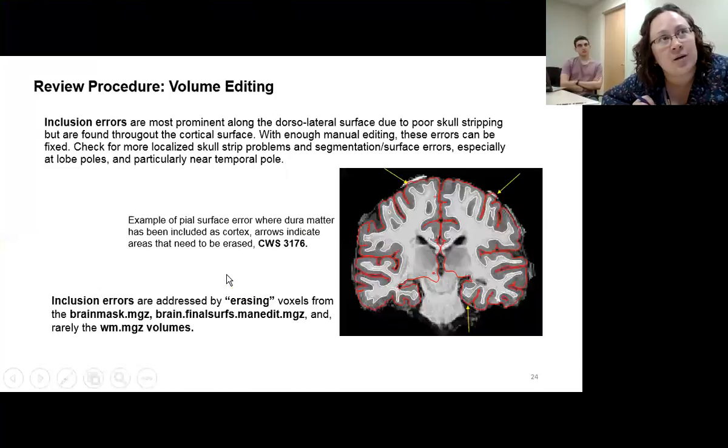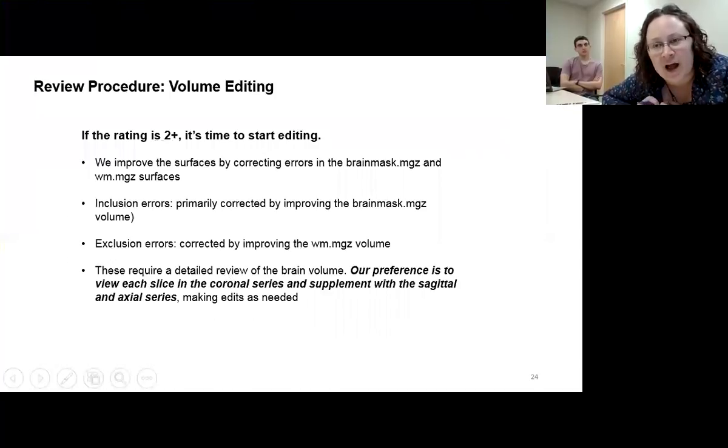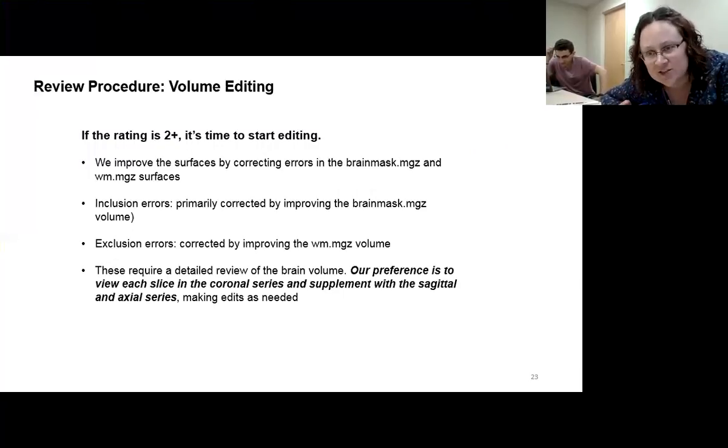There is one problem. I don't know if I can fix it. When I changed the permissions so that you guys could edit them, now we can no longer open them. I don't know how to fix that. There's a Boston group and then there's a psych group, and all I've ever been taught to do is go in, right click on the folder, say permissions, and then I can change the group. I thought, because the last group of training, Bobby was able to open stuff and so were the students, but they both just tried and it says permission denied when they tried to open the brain.